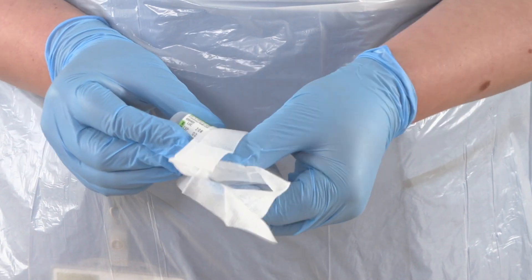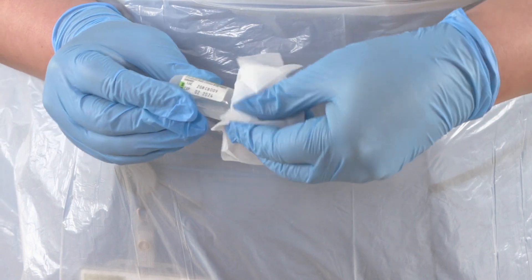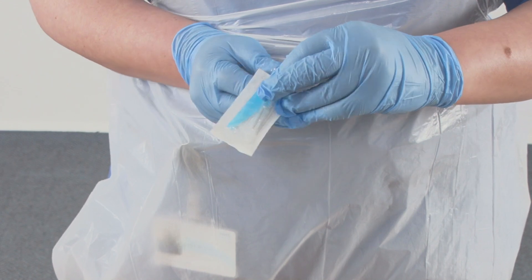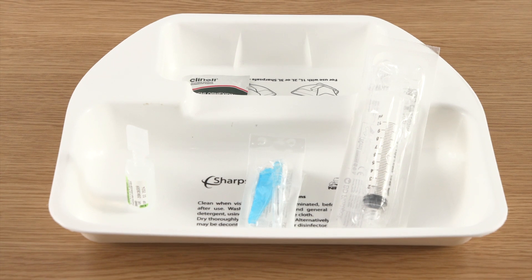I have performed hand hygiene again and put on new PPE. The first thing I am going to do now is decontaminate the neck of the flush ampoule using the wipe, doing this for 30 seconds and then allowing the solution to dry naturally, which also takes about 30 seconds.